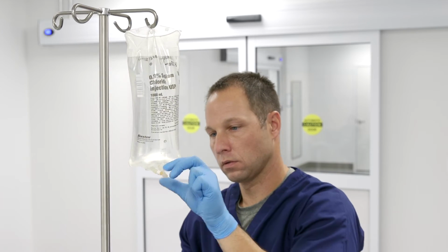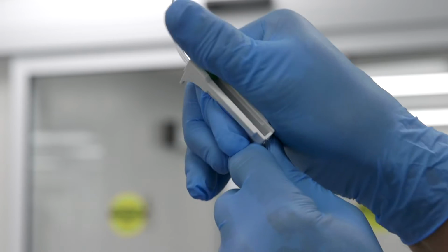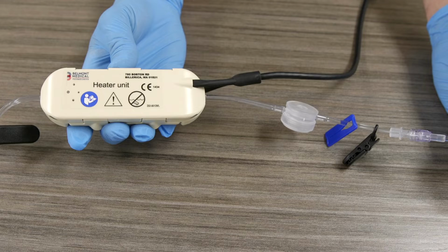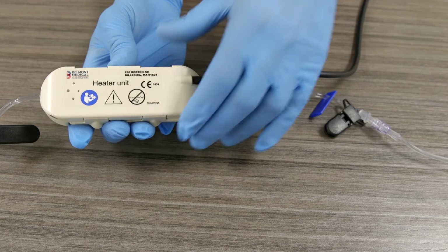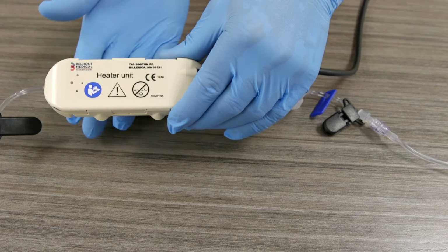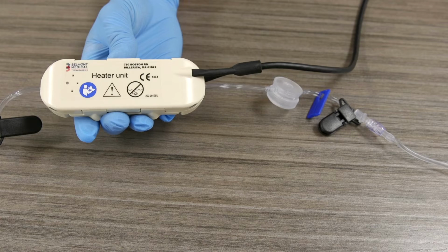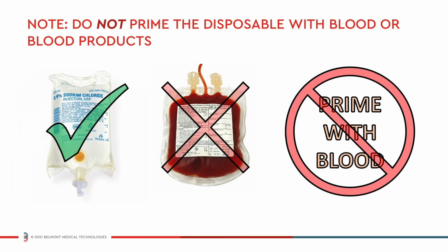First, hang and spike a fluid bag. Open the roller clamps of the administration set and prime the unit with saline solution, making sure that there is no air in the IV line. Tap the heater unit while priming to expel any air bubbles that may collect in the disposable. When you're sure that the disposable is primed and free of air, proceed to powering on the device. Note, do not prime the disposable with blood or blood products.